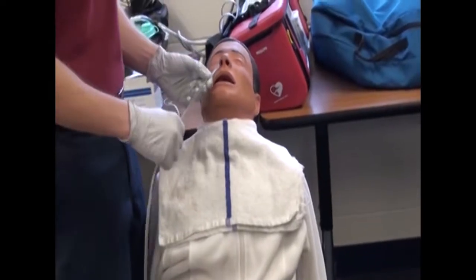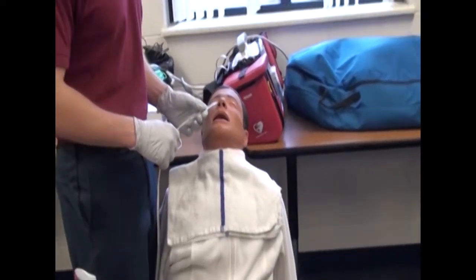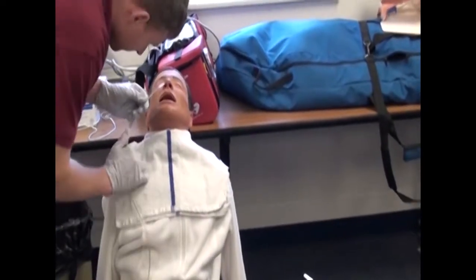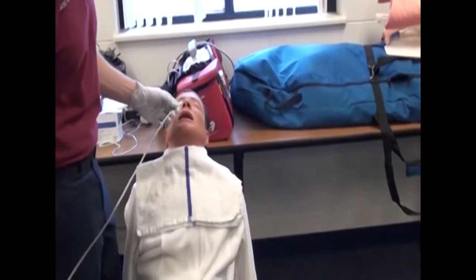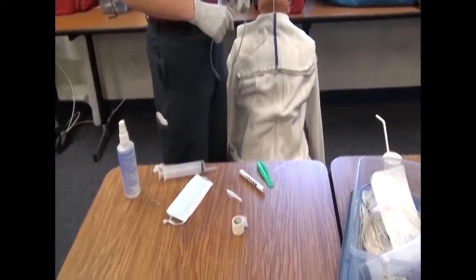Check placement by asking client to talk. Check posterior pharynx for presence of coiled tube. Just look in the back of the mouth again. Okay, good. Attach cone-tipped syringe to end of NG tube. It's right over here on the table. Attach cone-tipped syringe to end of NG tube.